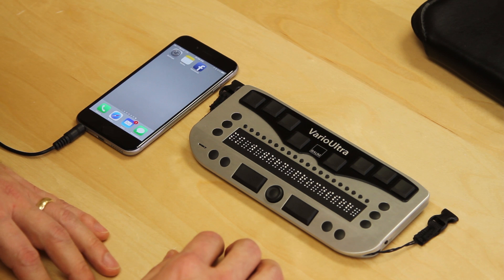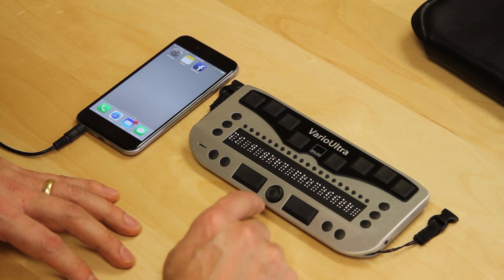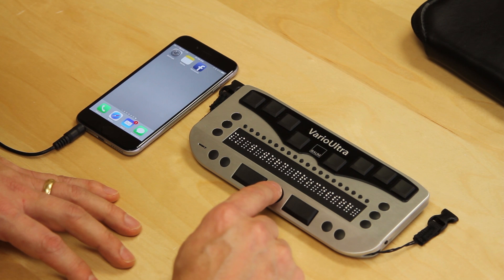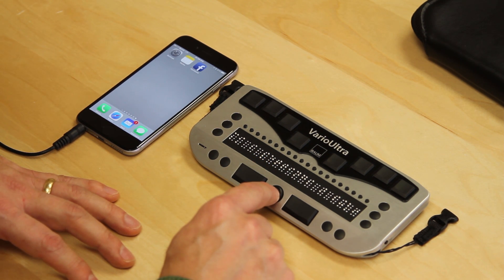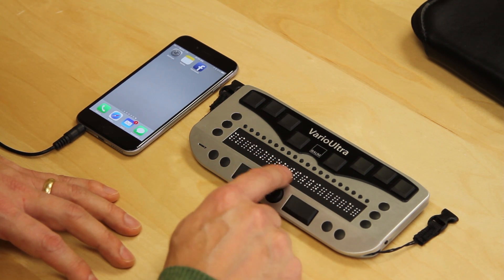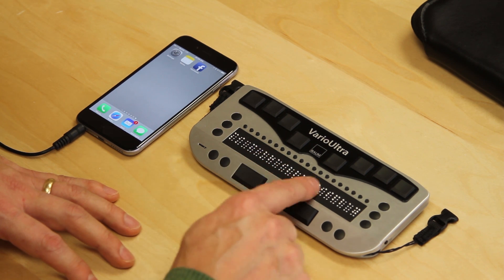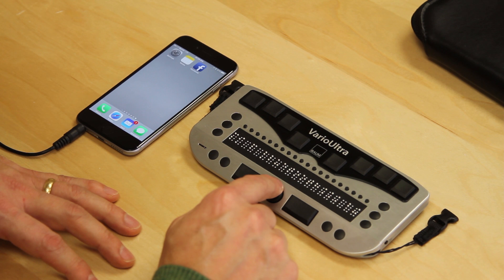I have an iPhone 6 on my left and a Vario Ultra 20. I'm in the Braille note-taker mode. I'm going to use my NaviStick. I tap up two lines and this brings me to the settings menu. I press in on the NaviStick to go into settings. The first thing we're going to read on the Braille display is alerts. I go up a line, it goes to Braille display, and then the next line is Bluetooth.